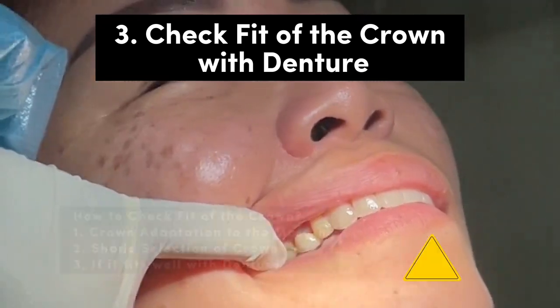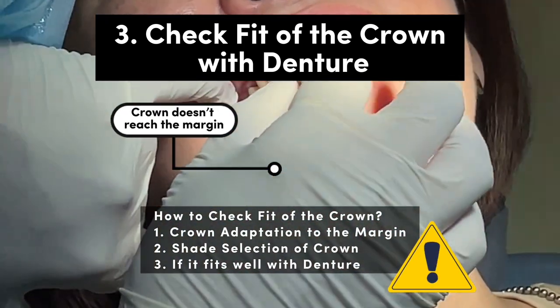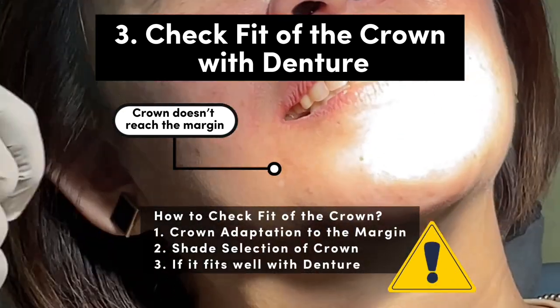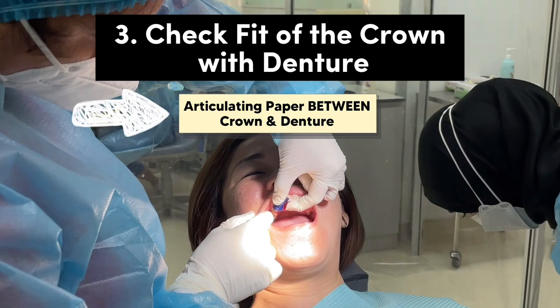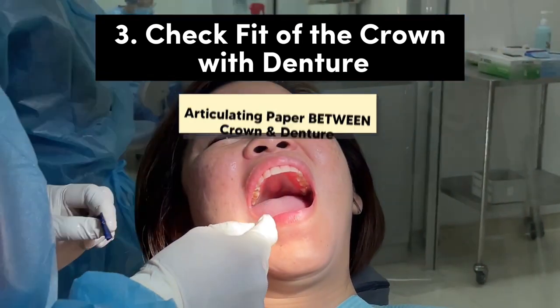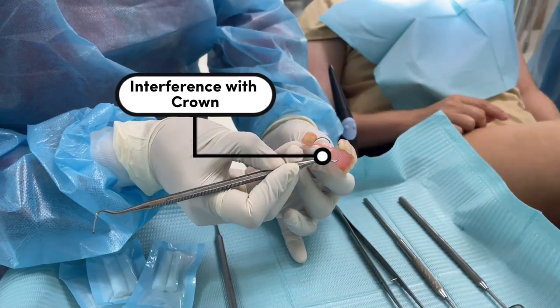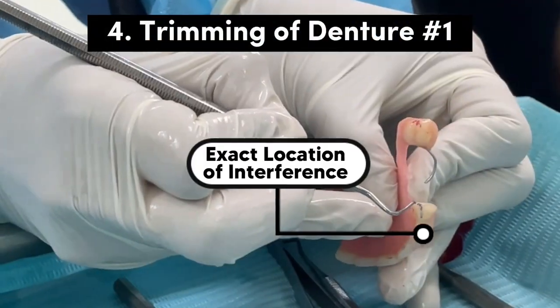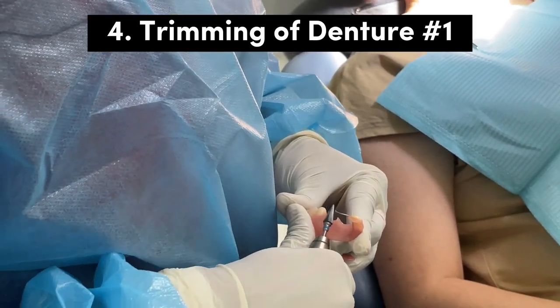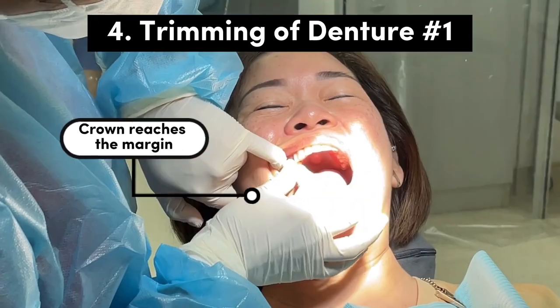We are going to check the fit of the crown — whether it is adapting to the margin. This patient has a removable partial denture, so we are trying the crown inside with the removable partial denture in place. We notice that the crown is not reaching until the margin. To find the exact location of the interference, we put articulating paper in between the removable partial denture and the crown. The removable partial denture is causing some interference, so we are going to trim it. Once trimming is done, we could note that the crown is going fully to the margin even with the removable partial denture inside.